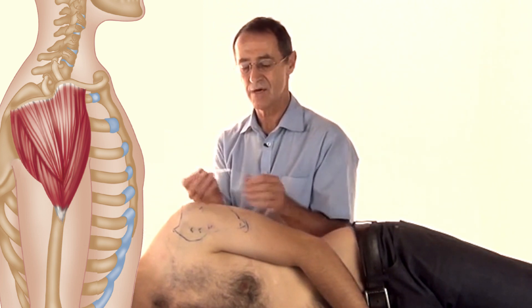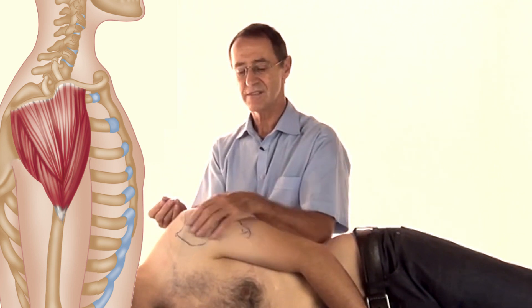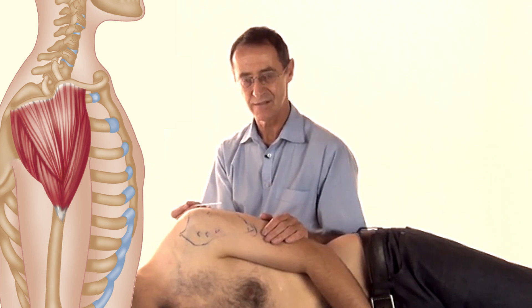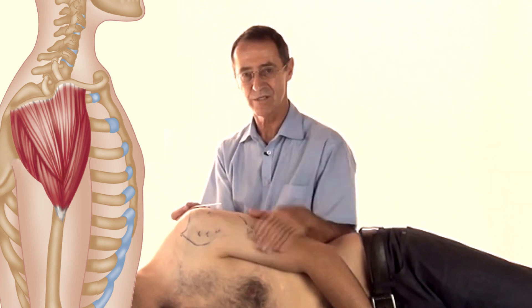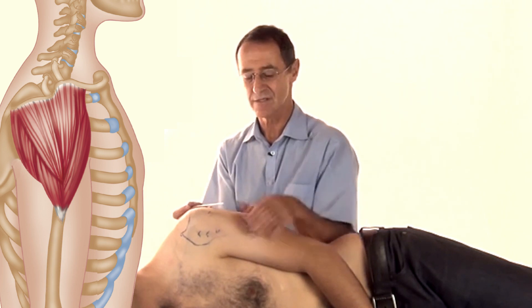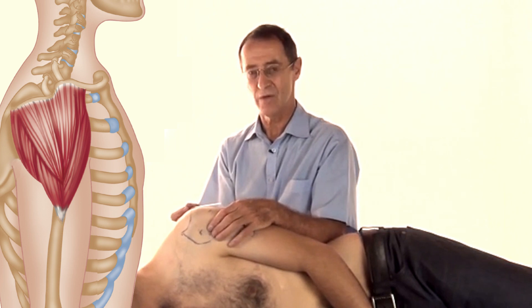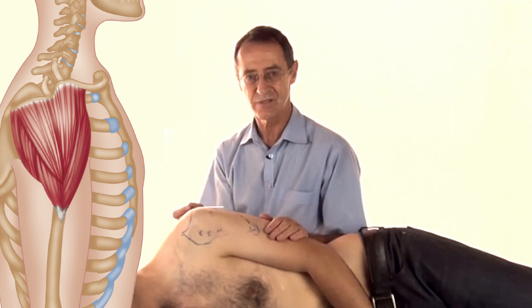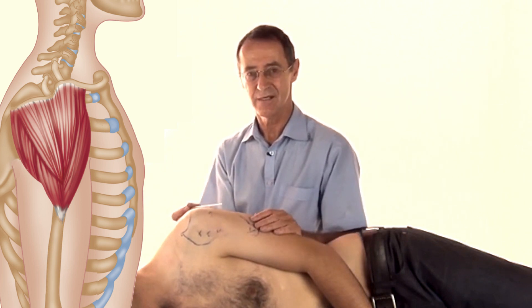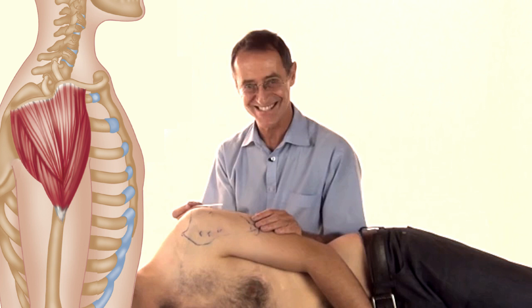We'll start with dry needling, which is using an acupuncture needle. This is an incredibly safe area to needle. In fact, this is the area where most people get injections, either here or out into your buttock. The reason this area is chosen is that there are no major structures that you can prang, which is very nice to know.